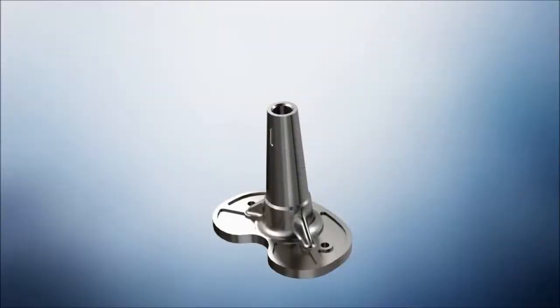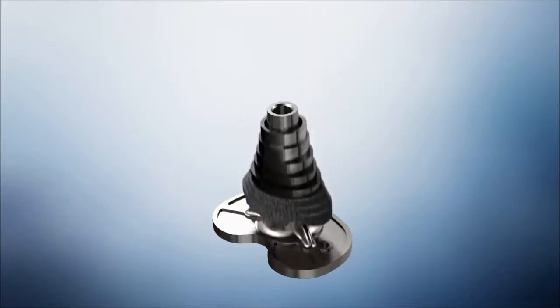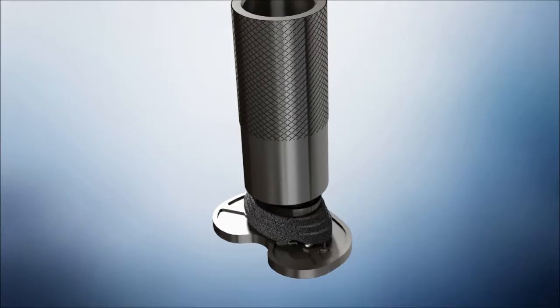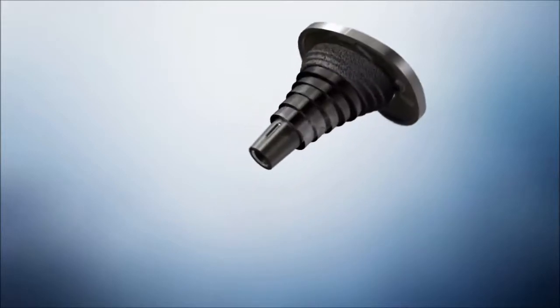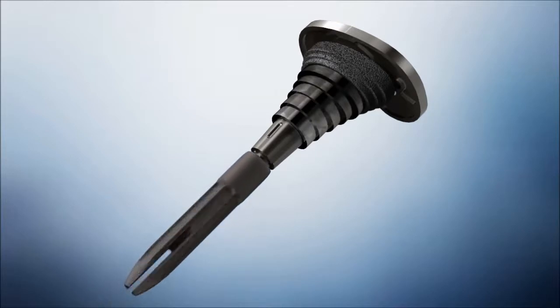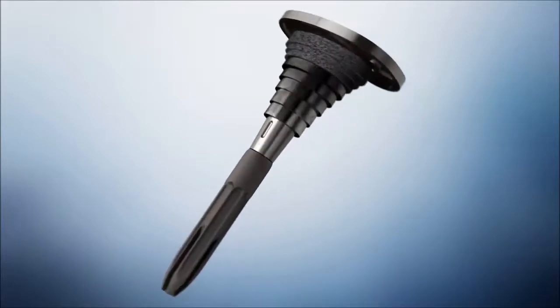For MBT revision tibial implant assembly, unscrew and remove the polyethylene cap from the end of the tibial tray. Assemble the tibial sleeve implant to the tibial tray, ensuring the tibial sleeve orientation matches the prepared canal. Use the sleeve impactor and a mallet to impact the sleeve onto the MBT revision tray. Attach the appropriately sized stem extension implant to the tray implant using the 2 wrenches to tighten and ensure full engagement.